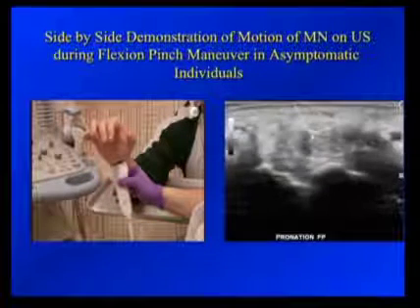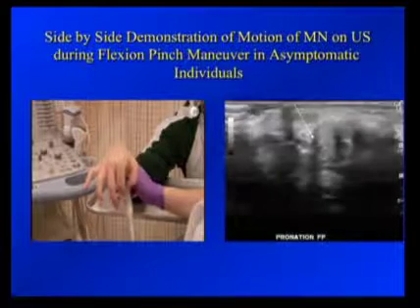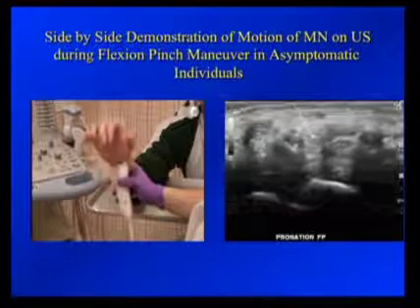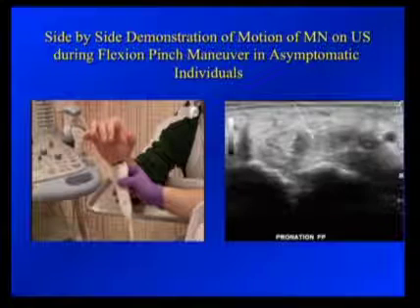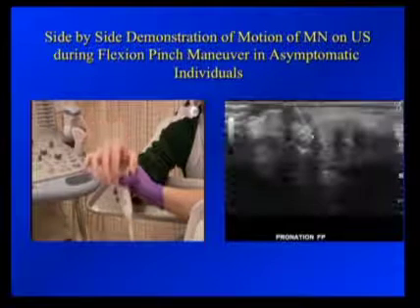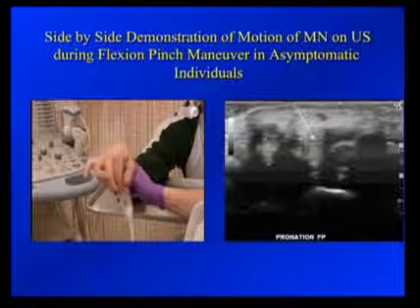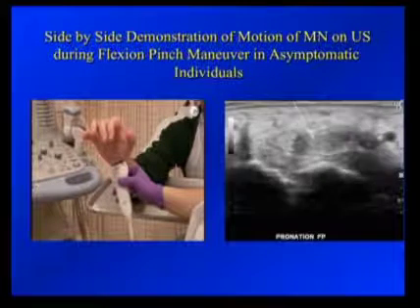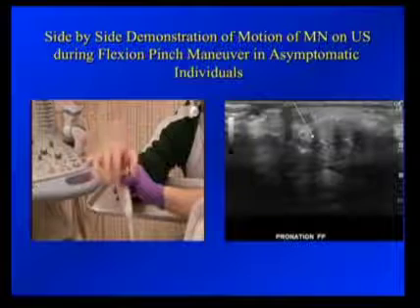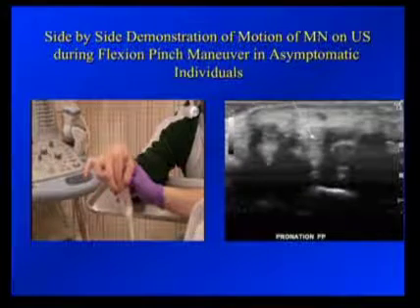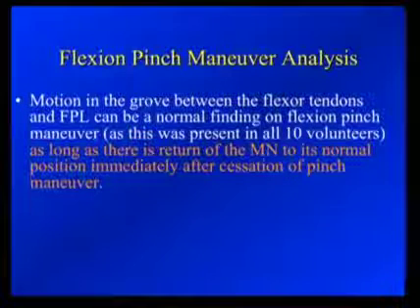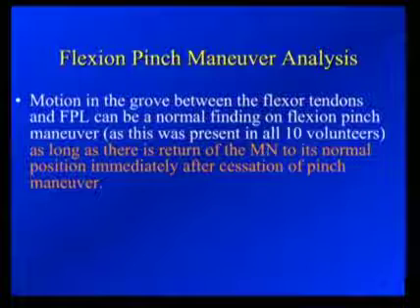The median nerve dives deep into the groove between the flexor pollicis longus and the flexor digitorum tendons. Upon return of the wrist to neutral, the median nerve very spontaneously reduces. Motion in the groove between the flexor tendons and the flexor pollicis longus is a normal finding.